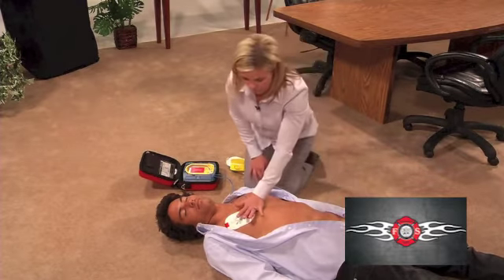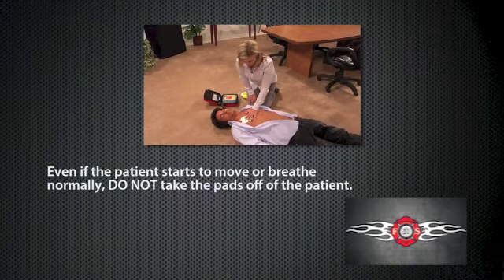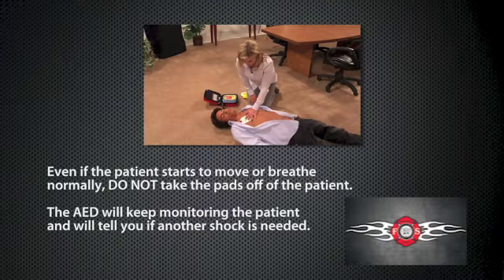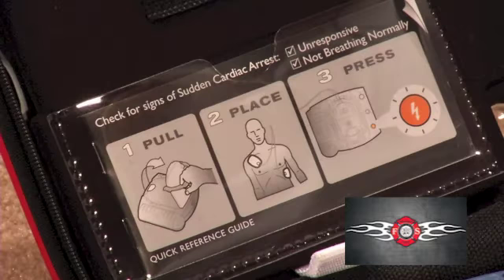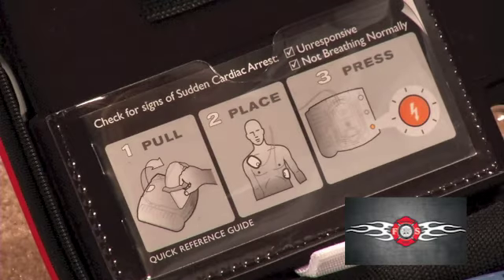If needed, begin CPR. Even if they start to move or breathe normally, do not take the pads off the patient. The AED will keep monitoring the patient and will tell you if another shock is needed. That's it. Just do what the AED tells you from the moment you turn it on. When the emergency medical team arrives, you may have saved critical time by starting treatment. Even better, you may have saved a life.